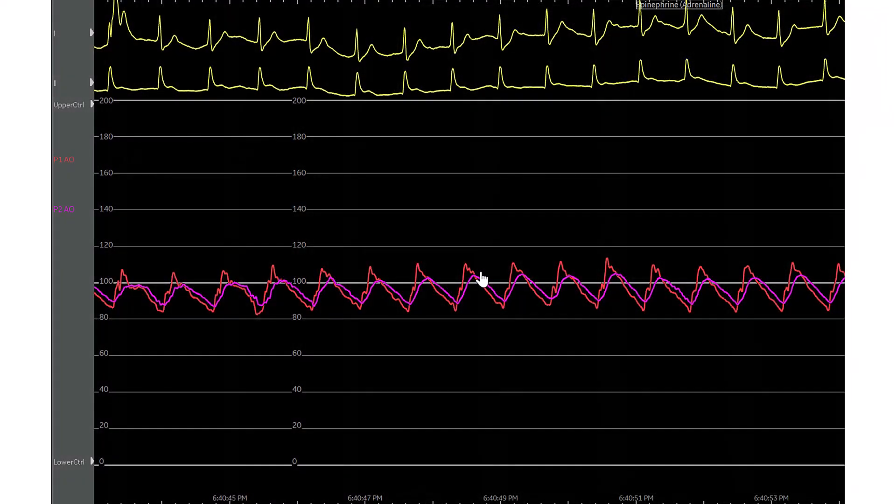The patient's hemodynamics, after the drain was placed, remained pretty good.